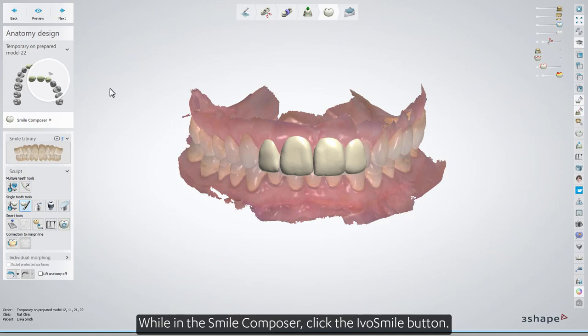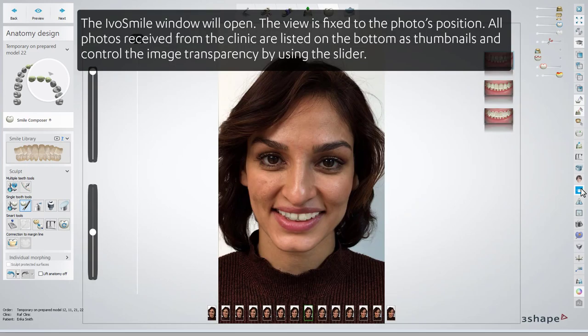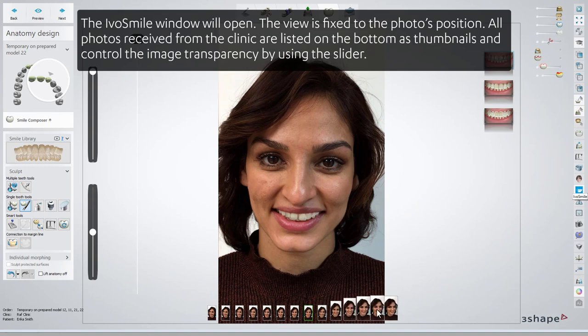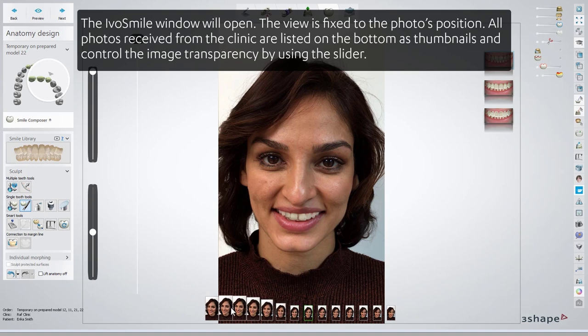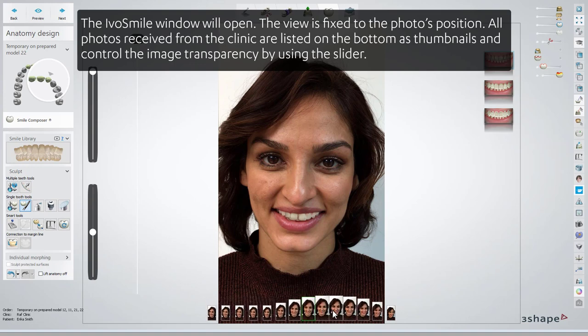While in the Smile Composer, click the IvoSmile button. The IvoSmile window will open. The view is fixed to the photo's position. All photos received from the clinic are listed on the bottom as thumbnails.